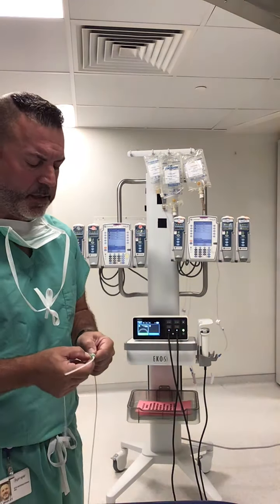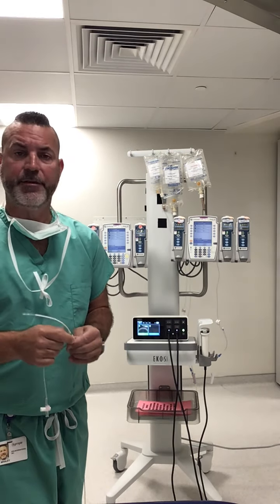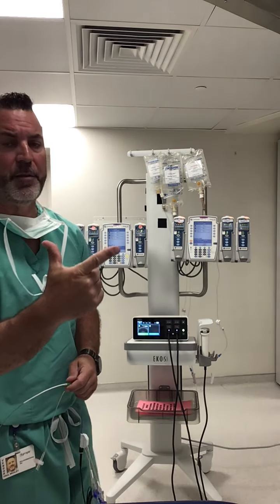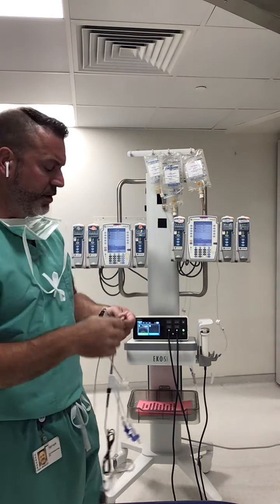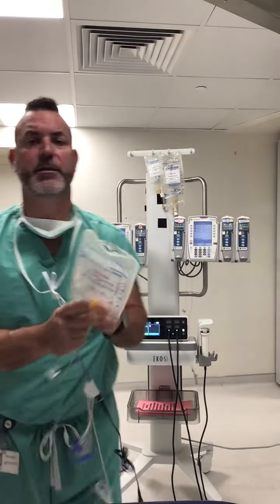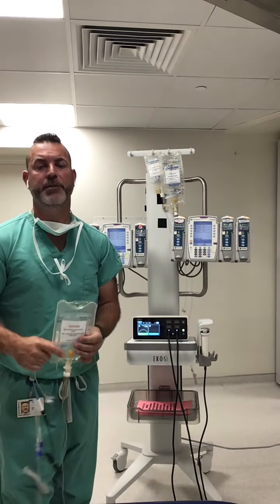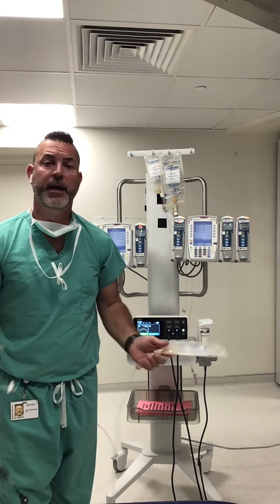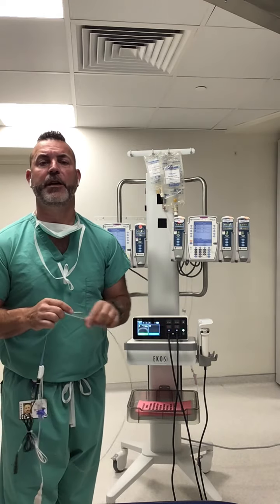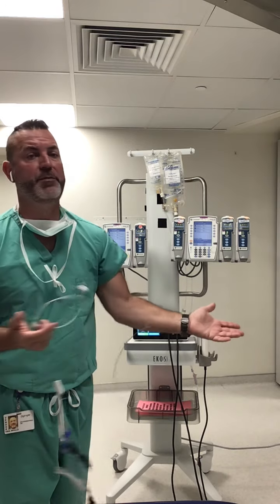I'm talking about it because, on average, most of your EKOS patients are going to have 3 fluids. Now, we've talked about our normal saline coolant and our TPA, or thrombolytic, that's flowing through our catheter. But the third fluid you're going to typically see is your heparinized drip, your heparin drip, okay? So most of our vascular patients across the country, at least here in the United States, are on a heparin drip. Heparin, on average, is going to be seen flowing through the side arm of your sheath. It could be peripheral or it could be not going at all.